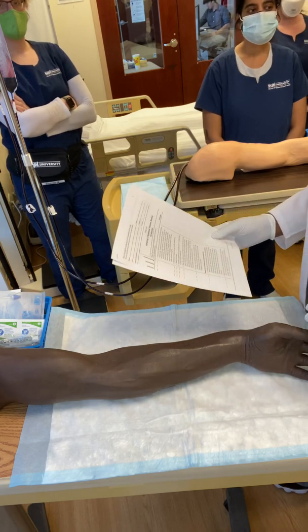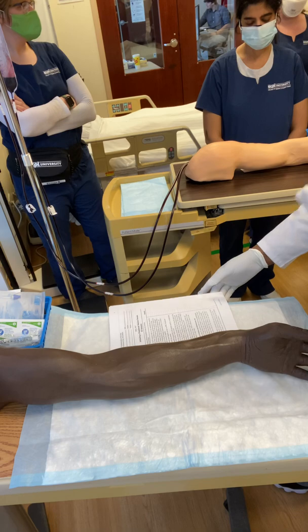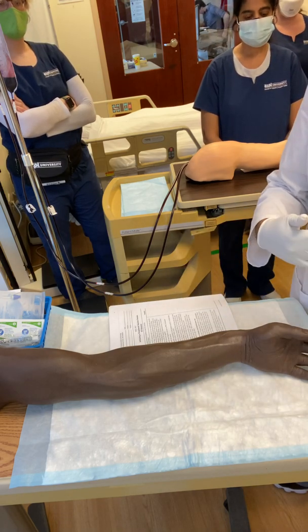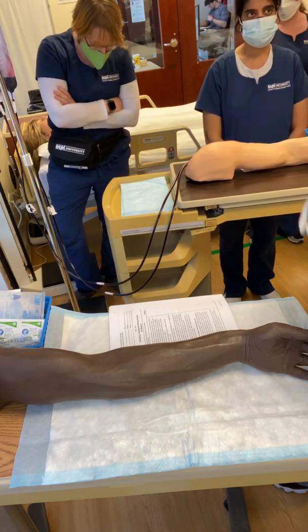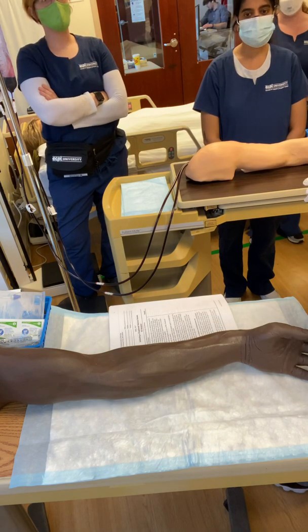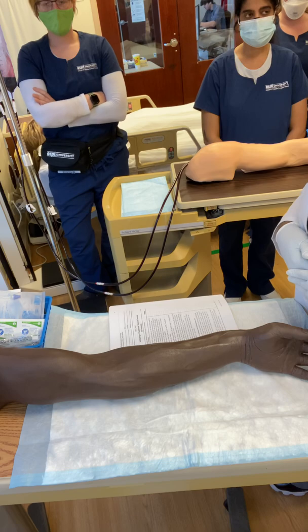Perfect. Now that we got our order, we're going to assess the patient if they have any allergies, okay? This is important, especially if they have any allergies to any type of contrast dye or anything, because typically in the IV kits, they might have some betadine or something in it, and we might need to replace it with something else, okay?